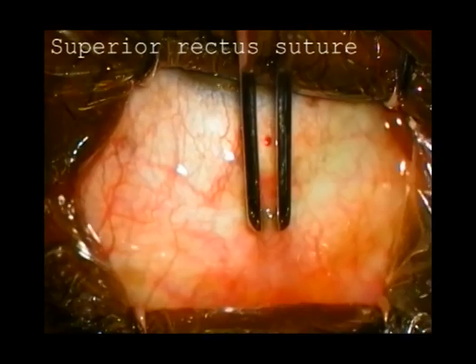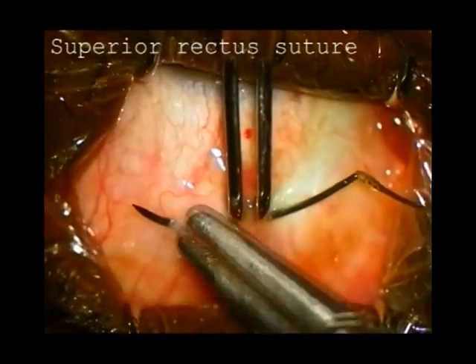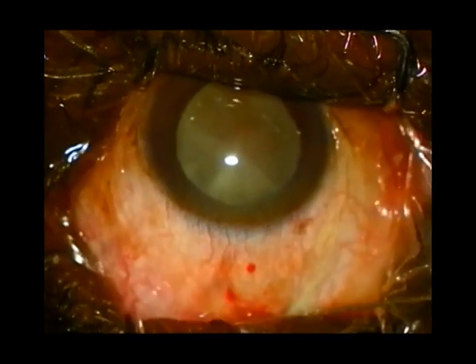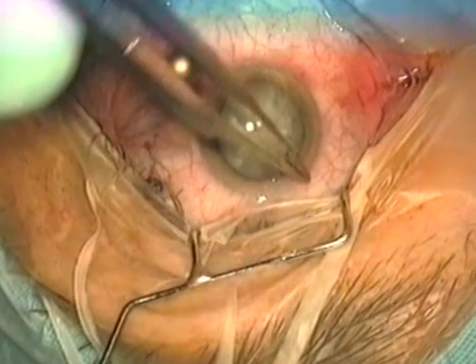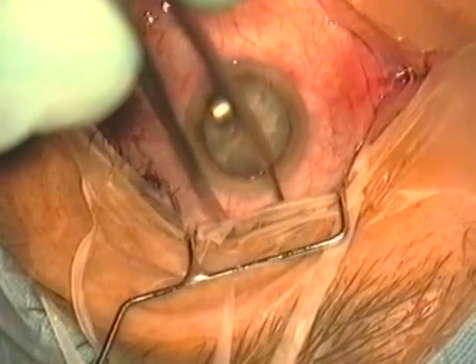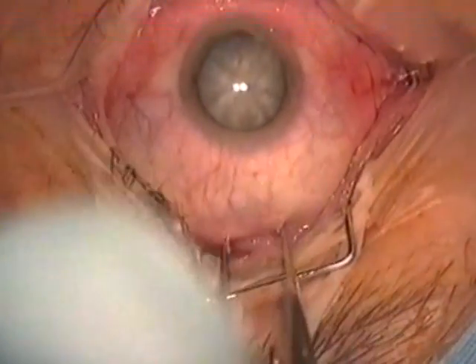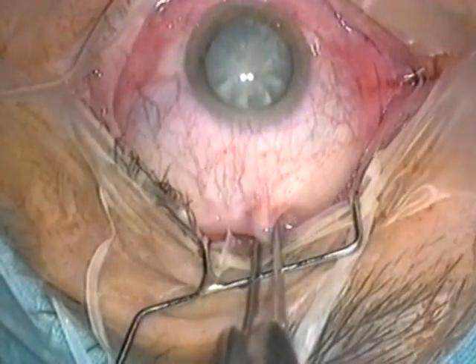We will show first a sutured extracapsular cataract extraction. At the beginning of the operation, a 4-0 silk suture is passed under the superior rectus muscle. This is done by inserting tooth forceps closed into the upper fornix, opening the forceps, rotating the eye on the open forceps, and then grasping the superior rectus muscle.